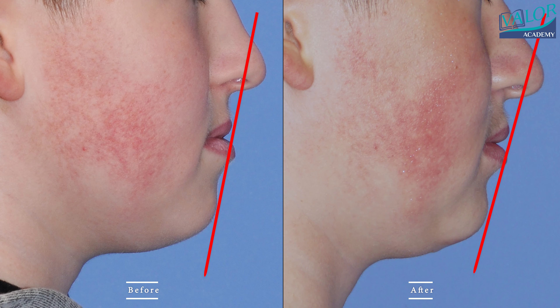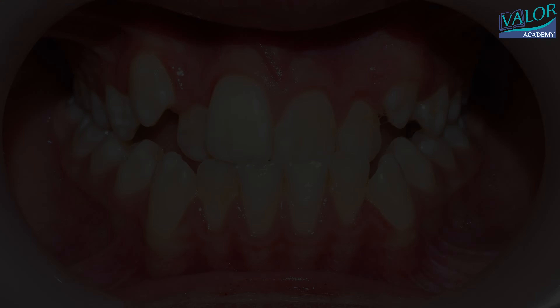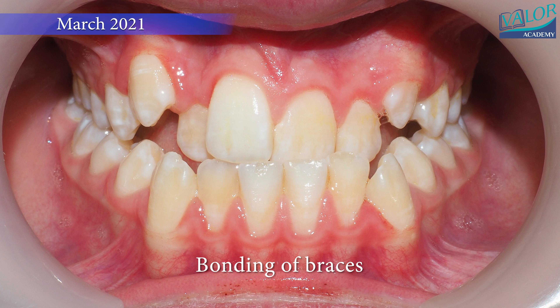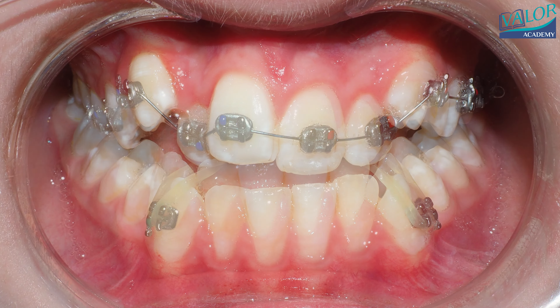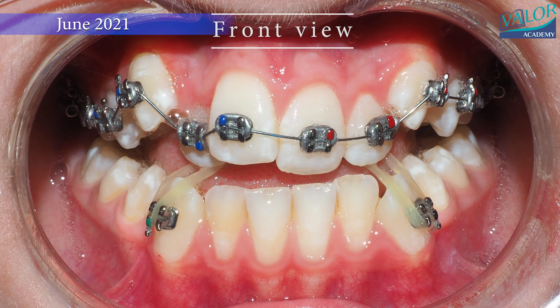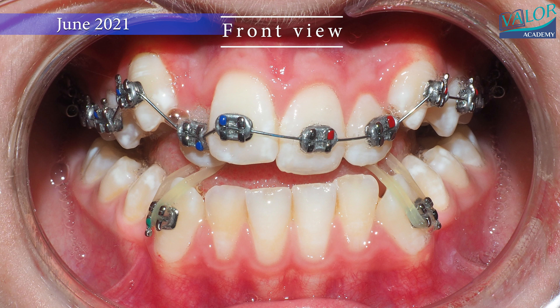The primary goal in Phase I treatment for Class III patients is to develop the maxilla and its dentition. This involves expanding the maxillary dental arch and aligning the teeth to correct the crossbite. The aim is to prevent overdevelopment of the mandible during the pubertal growth spurt.